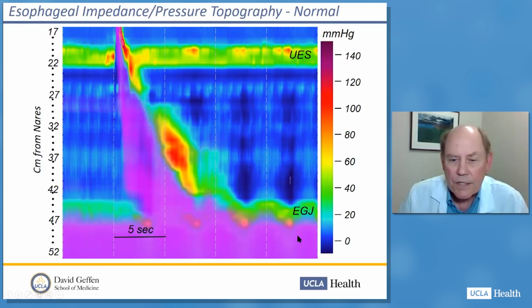This is the impedance in the stomach. It's not because the stomach is full, it's because the stomach is a secretory organ. So there is ionic movement across the epithelium. And when there's ionic movement across the epithelium or the mucosa, it is detected as a low impedance.